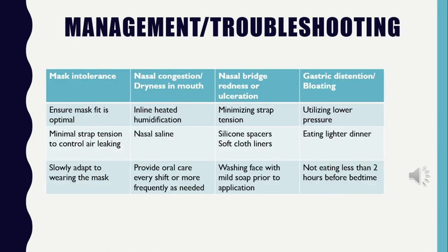Okay, so here's a very important slide that you want to review more closely. In regards to the adverse effects of the BiPAP mask, one of them, of course, is mask intolerance. You want to make sure you measure the nasal bridge to underneath their mouth correctly and use the fittings that are on the bags with the BiPAP masks. You also want to make sure there's minimal strap tension to control air leaking.